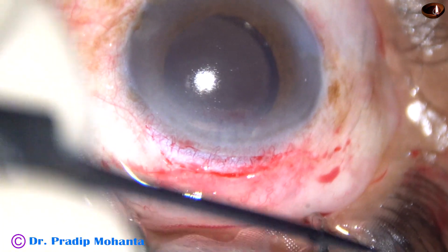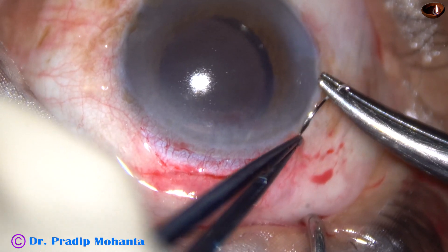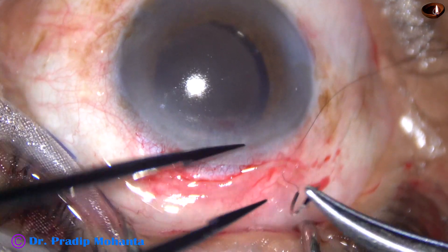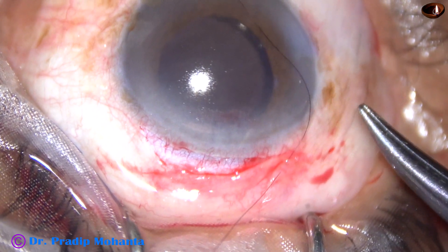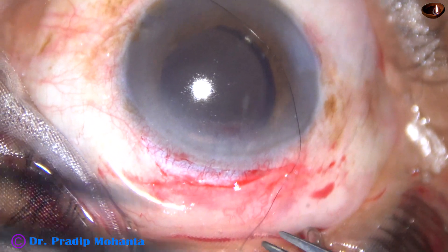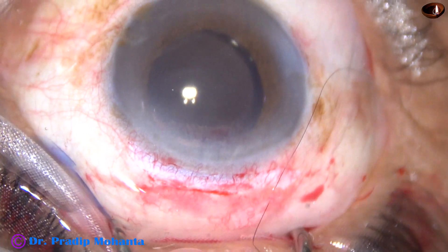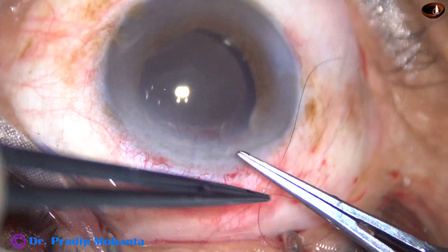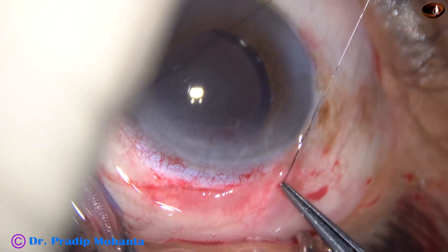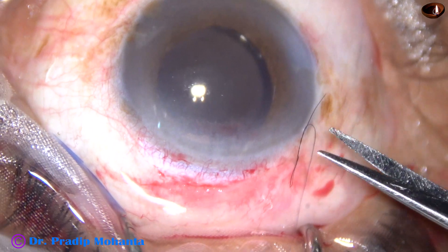See it again. You can use a plain forceps for conjunctiva. Pull the thread. Come to the end of the thread. And now take three loops like this — one, two, three. Hold it. And just pull it. And cut the thread with the needle near the knot.